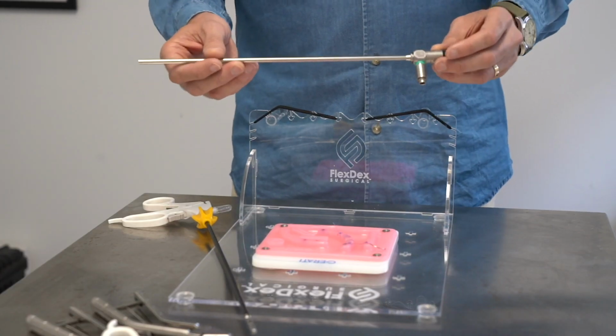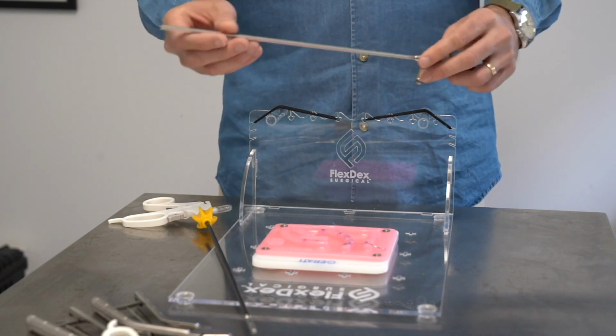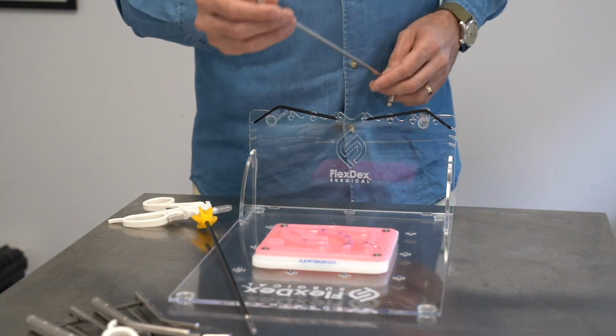The laparoscopic telescope. They come in numerous different sizes. This is a 5.0 millimeter laparoscope with a 0-degree offset, which means that whatever the scope is pointing at is exactly what you see in the camera.